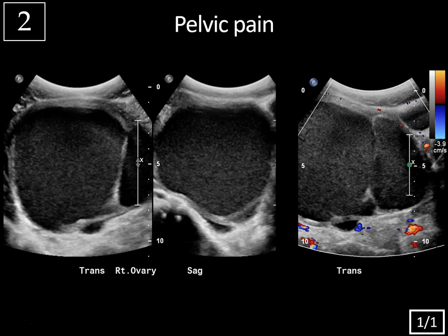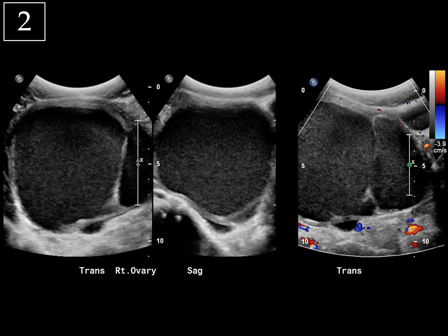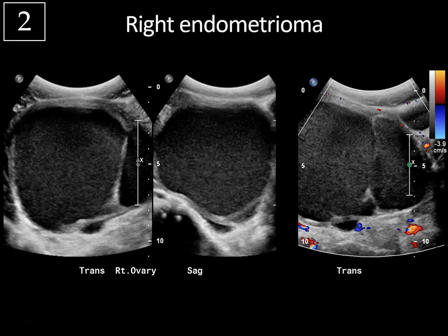Next case, history of pelvic pain, slide one of one. So we're looking at a large mass in the right ovary, and it has characteristic homogeneous, diffuse, low-level echoes throughout it. There's also a thin septation, but we don't see any abnormal vascularity — no mural nodule or any areas of suspicious blood flow. This is typical for an endometrioma. These patients often have a history of dysmenorrhea and pain. They may have infertility, and the symptoms are often cyclical. They can be treated either with hormonal therapy or resection. There is a very low rate of malignant transformation, about one percent.